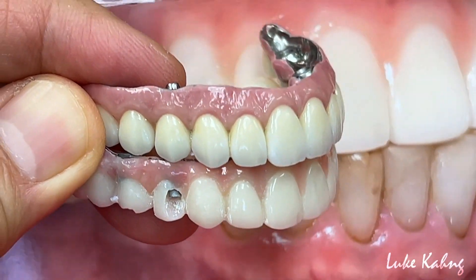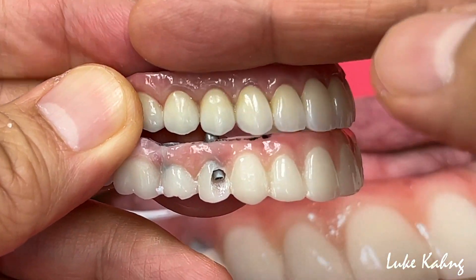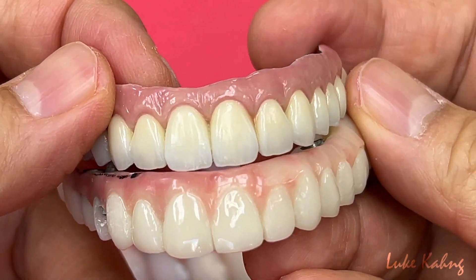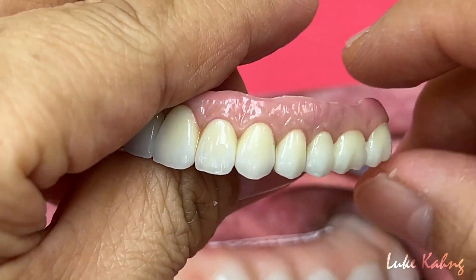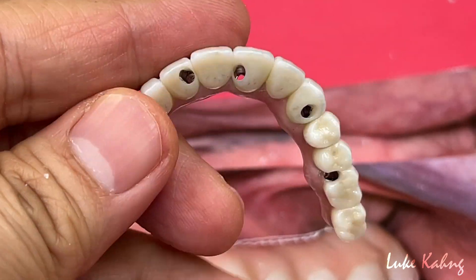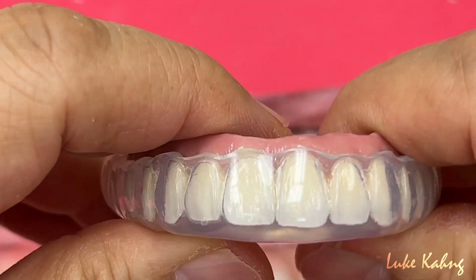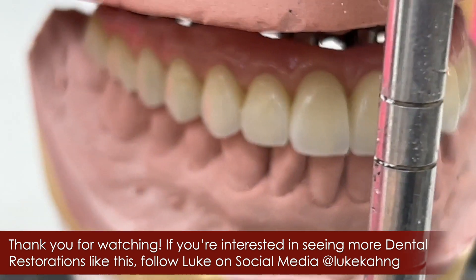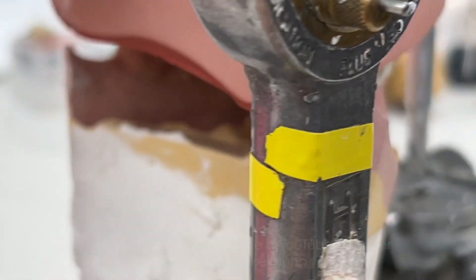This is the PMMA from try-in, and here is the PMMA — it's raised, which means it's overlapping with better contour and shape, same as the other side too. So now it looks great — we did it. They're all finally done.